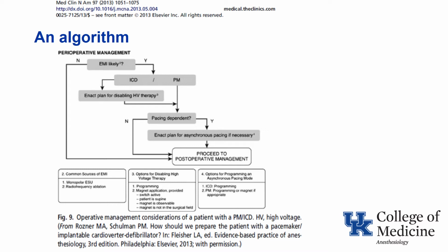Now, for cardiac surgery, the magnet can be in the surgical field if placed in a sterile bag and the surgeon is willing to take the responsibility for its management. One reason why some cardiac surgeons may decline reprogramming in the perioperative period is that they do not have control over the pacemaker, and that it could be placed in an asynchronous mode, and that an R on T beat might occur and fibrillation might ensue. It is possible, but not very common in my experience in the cardiac OR.